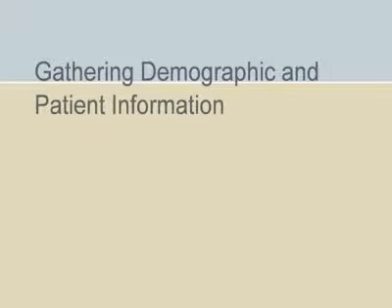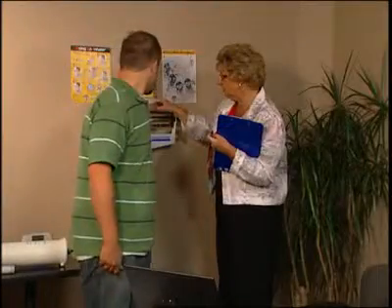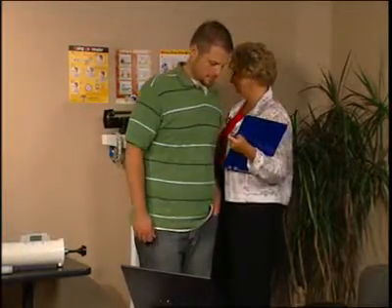Once you've introduced yourself and acquainted the patient with the spirometry test process, document various patient attributes: height, weight, age on day of testing, gender, and race. Record the patient's weight to the nearest pound or kilogram. Weight is generally not required for the predicted reference value, but documenting the patient's weight accurately is important nonetheless, especially during the interpretation of test results.